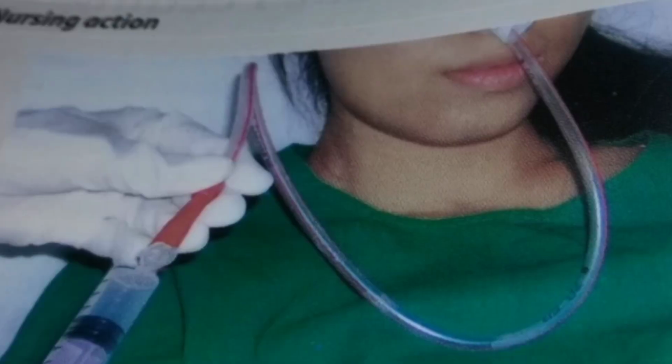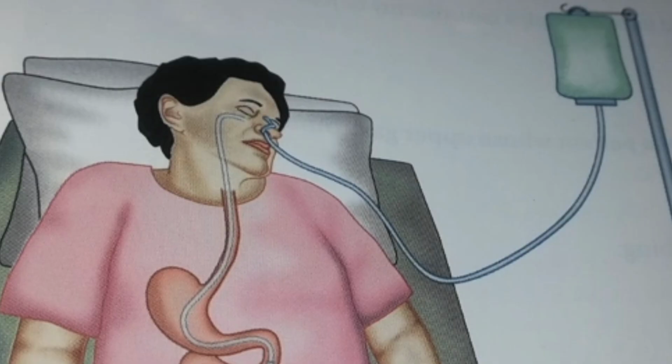So first we have seen the definition, then purpose, indication, articles, and procedure. This is all about how to give nasogastric feeding to the patient.